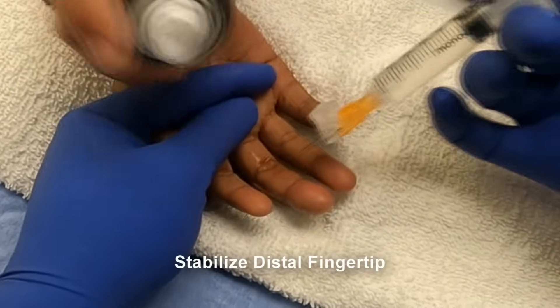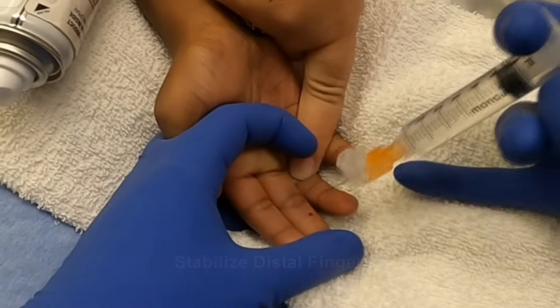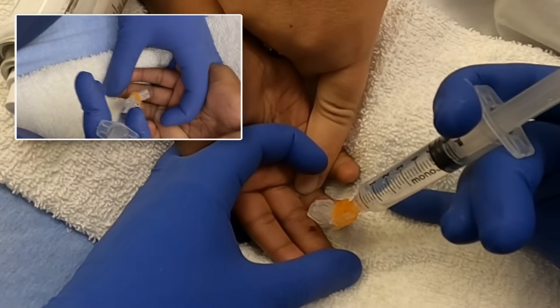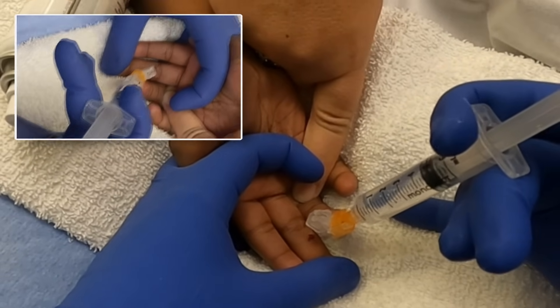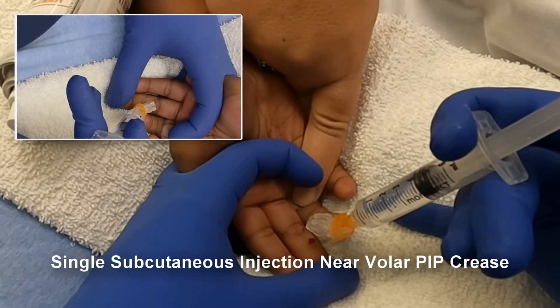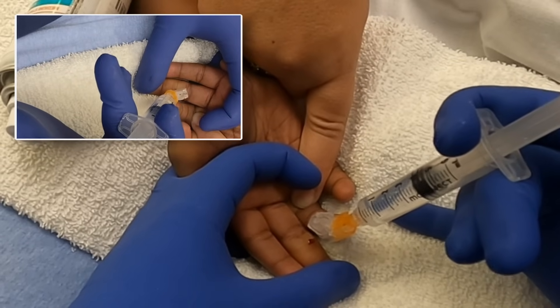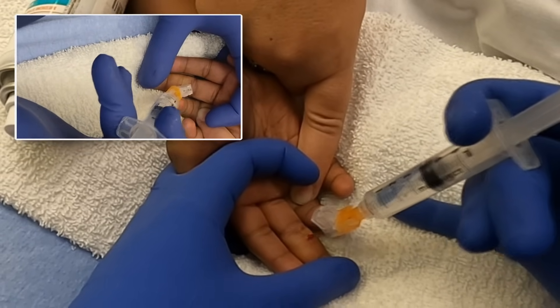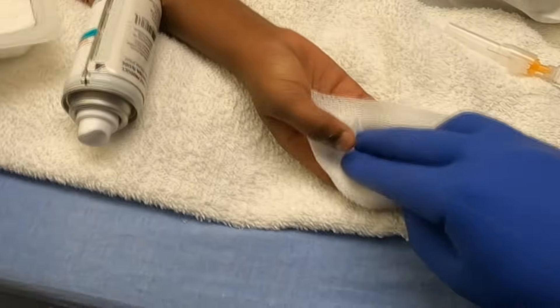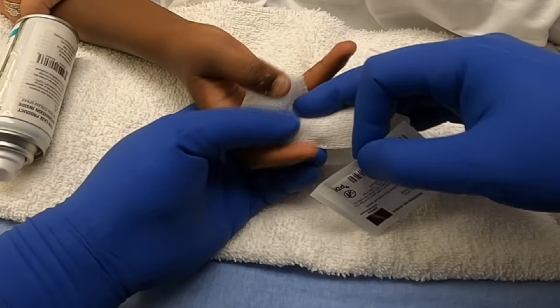Hold real still — just injecting the lidocaine, trying to infiltrate about one to two cc's right in the subcutaneous space until we can see the wheal form.